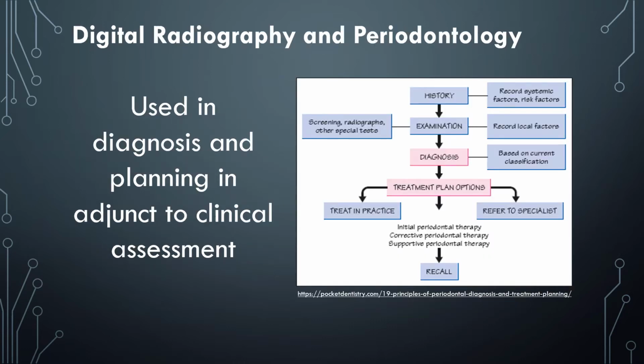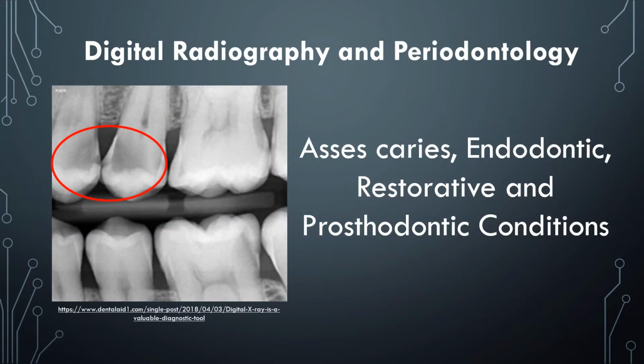Digital radiographs are an integral component of assessment, diagnosis, and treatment planning for those with clinical evidence of periodontal destruction and can be used in all stages of care. These images can identify caries, endodontic, restorative, and prosthodontic conditions which can impact treatment planning.